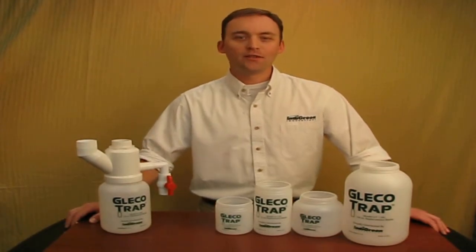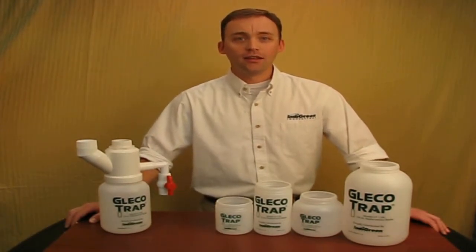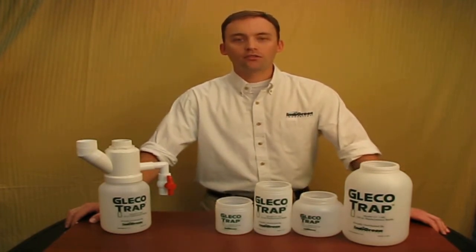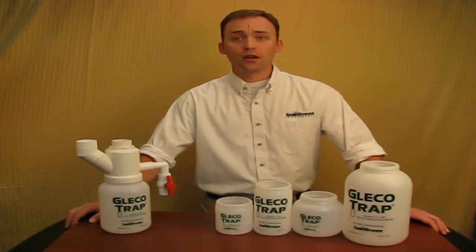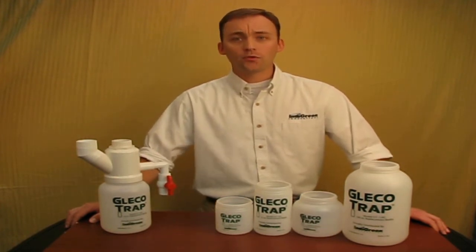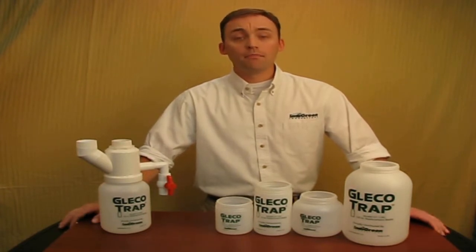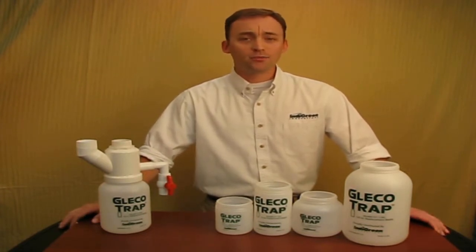Hi, David Brown here with the IndiGreen Innovations Brighter Idea of the Day. Like most dental offices, orthodontic practices, or dental labs, you probably use a sediment trap to separate plaster, stone, and other materials from your main drainage line. Old-fashioned metal traps require a lot of maintenance and are difficult to install. Standard disposable traps are awkward and messy — and have we mentioned that smell?